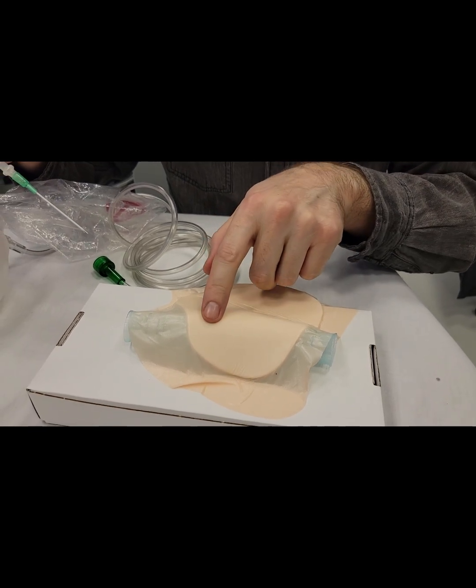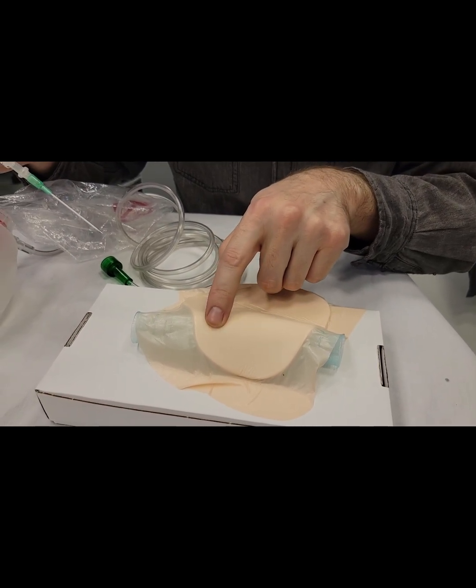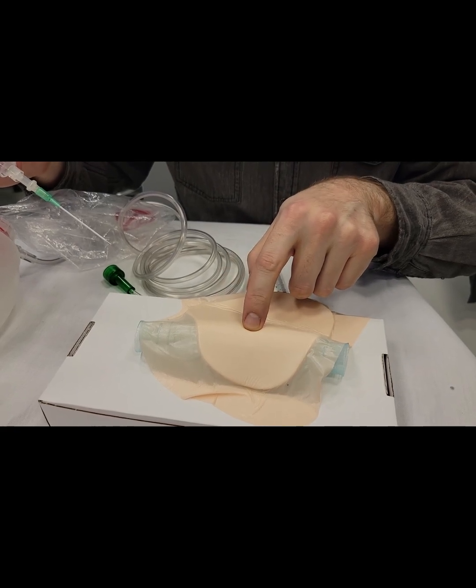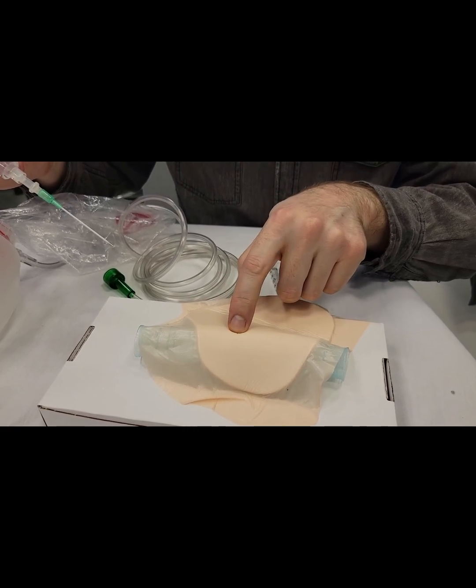Go ahead and palpate your landmarks. It will be superiorly the thyroid cartilage, inferiorly will be the cricoid cartilage. Between there is the cricothyroid membrane.